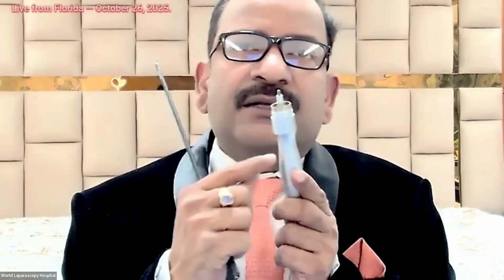But remember, harmonic is a mechanical energy, it is not an electrical energy. Inside this transducer there is a piezoelectric crystal, and once the current goes to the piezoelectric crystal, it vibrates, as high as 55,500 vibrations per second, and due to that vibration your instrument vibrates and produces the mechanical energy.